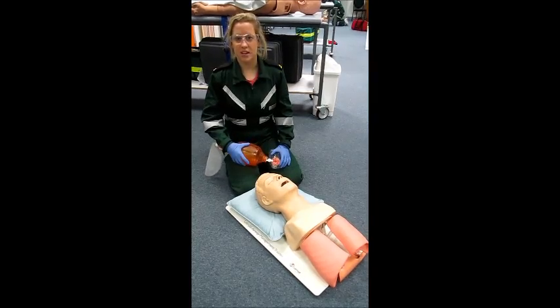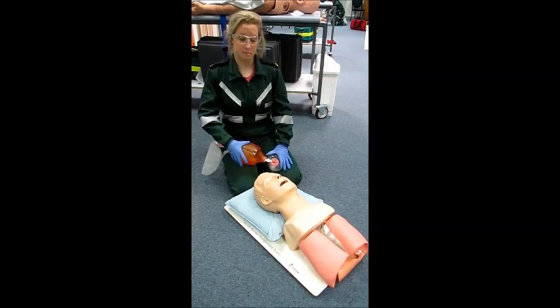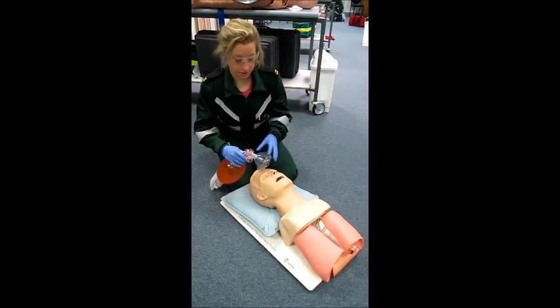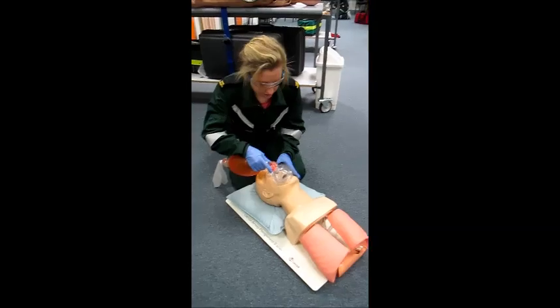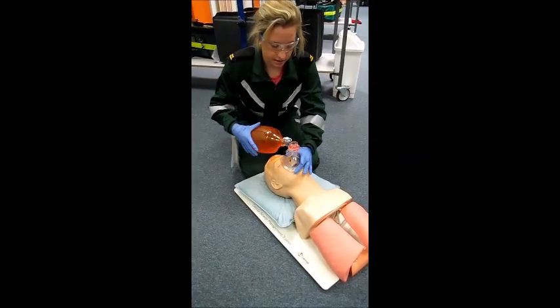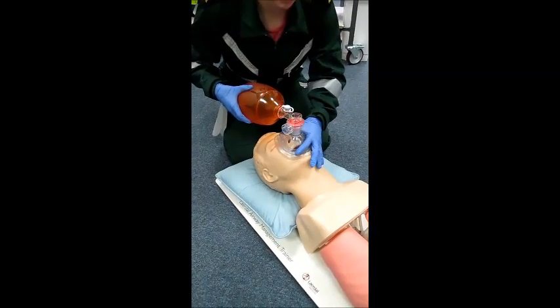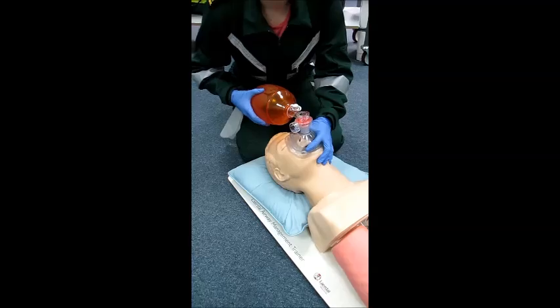I'll now be demonstrating assisted positive pressure ventilation using the bag valve mask for the unconscious, non-breathing patient. First, using the appropriate size face mask, we need to achieve a seal. To do this we roll it over the nose and mouth, squeezing the cheeks in. Once the seal is achieved we can maintain this using the C-grip, which involves the thumb and index finger on the mask and the remaining fingers on the body of the mandible to help achieve a head tilt.